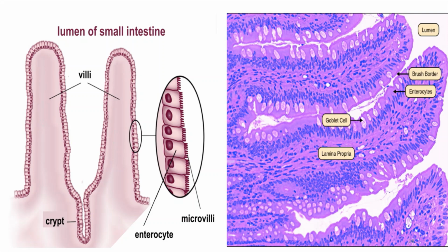As you can see here, these cells are simple columnar epithelia. When you draw this simple columnar epithelia, on a basement membrane of course, also show the microvilli on top of it. That's what you are going to draw at high power. Draw a part of the villus, but specifically show the simple columnar epithelial cells. On top of the cells, you should show the microvilli.